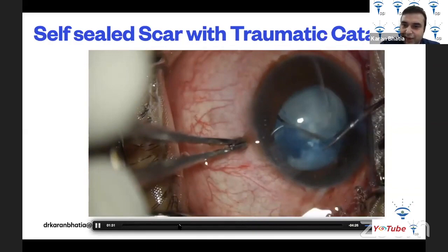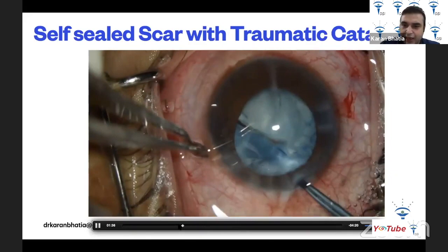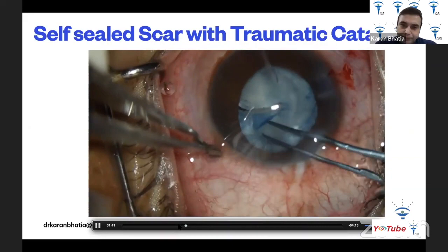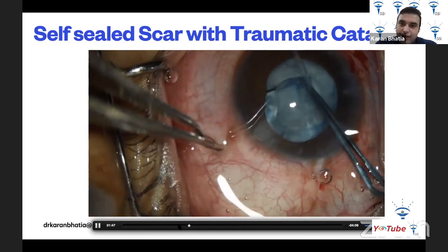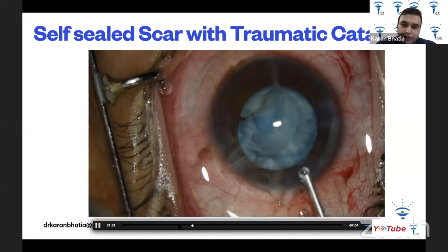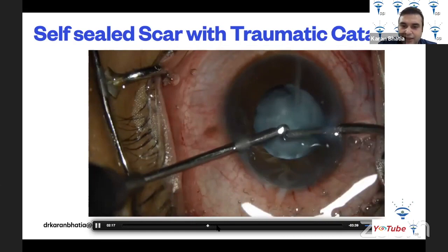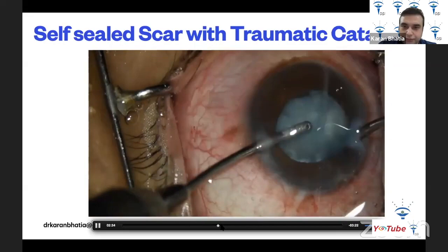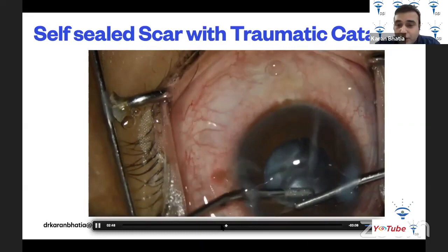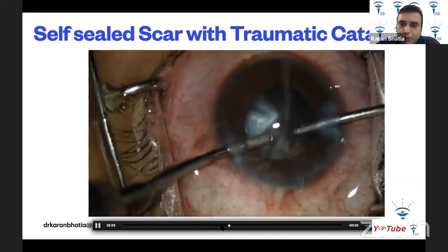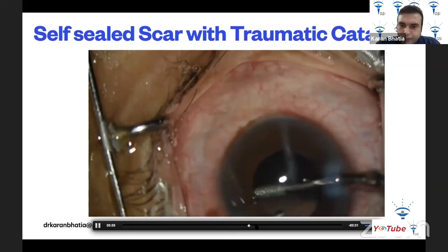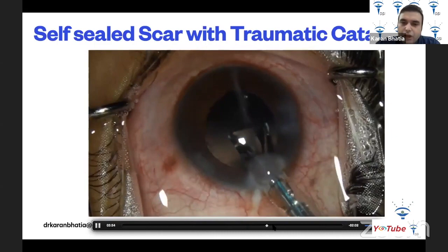The anterior capsule is cut and converted into a rhexis using Haldipurkar forceps. Fibrotic areas require micro scissors. Once this is done, removing the remaining lens is straightforward — aspiration is done and the lens comes out easily. Since this is an adult eye, a primary posterior capsulotomy is not performed. A vitrectomy cutter or rhexis forceps can be used for that purpose if needed. After PC polishing, a foldable lens is implanted into the bag.